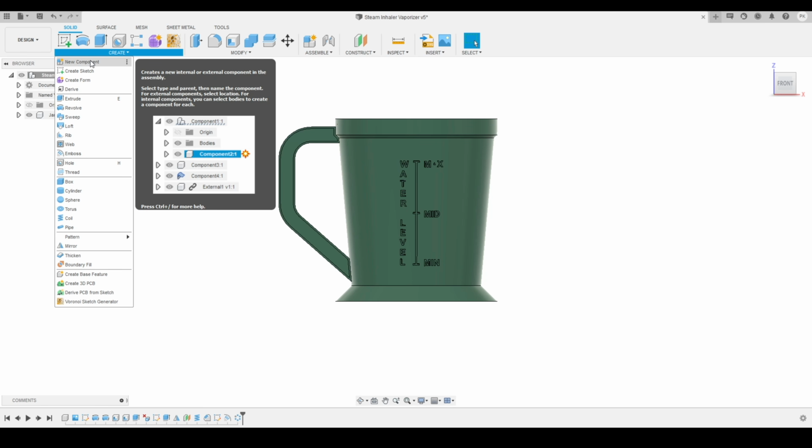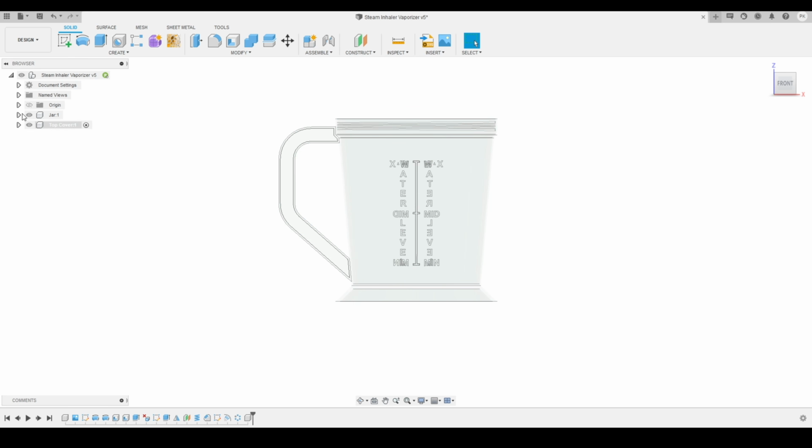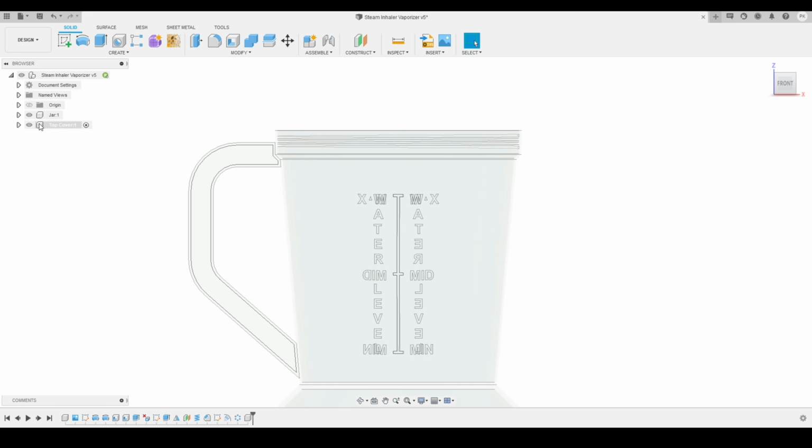We'll move on to creating a new component now. We'll click on new component, we'll rename this component, we want this as a top cover, and we'll press OK to create the component. Here you can see it has been created in the tree, and we have two different components, but now the top cover component is active, and the other one is grayed out because the transparency of a non-active component is reduced by default.